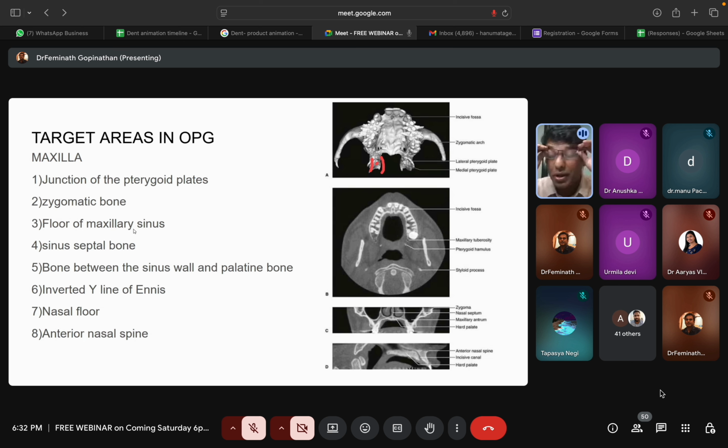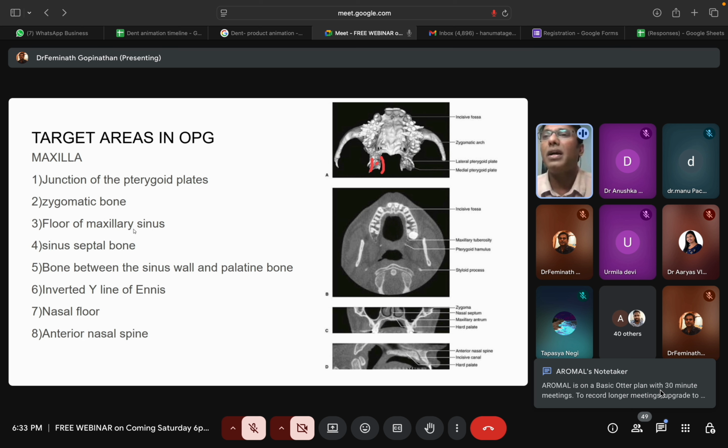There are a lot of things to be taught as far as occlusion is concerned. If you don't follow this protocol, just imagine, in a conventional implant, you place the implants in an alveolar bone, whereas we place it in a cortical bone, which is far away from the tooth. Just by logic, by common sense, you should understand that there is a lot of distance traveled. So naturally, the surface area of bone to implant contact is more. Which has more likely chances of failure: when you have more implant to bone contact, or when you have less bone to implant contact as in conventional implants? It holds logic that the chances of failure are less when you have more implant to bone contact.